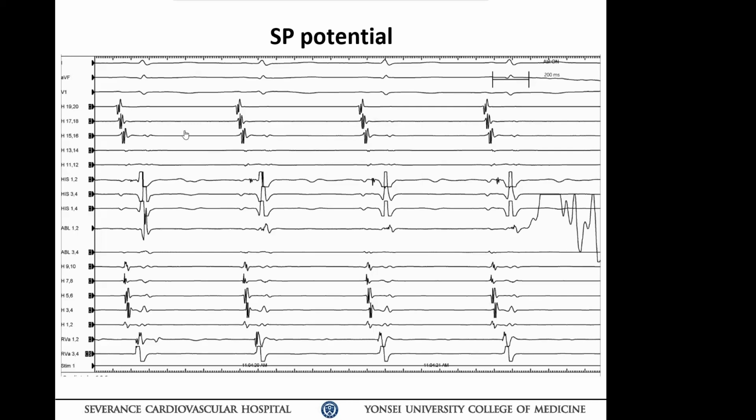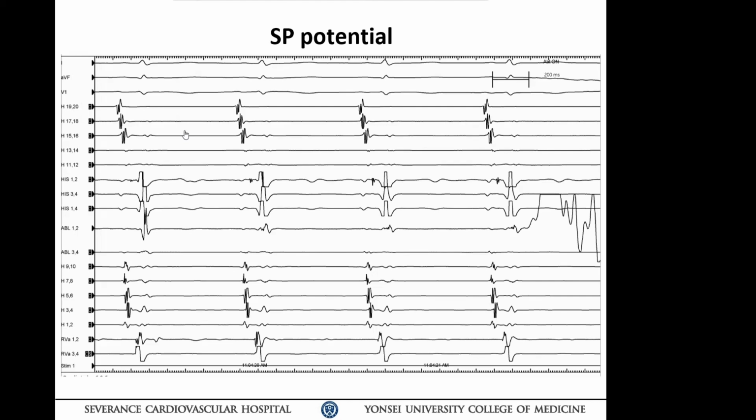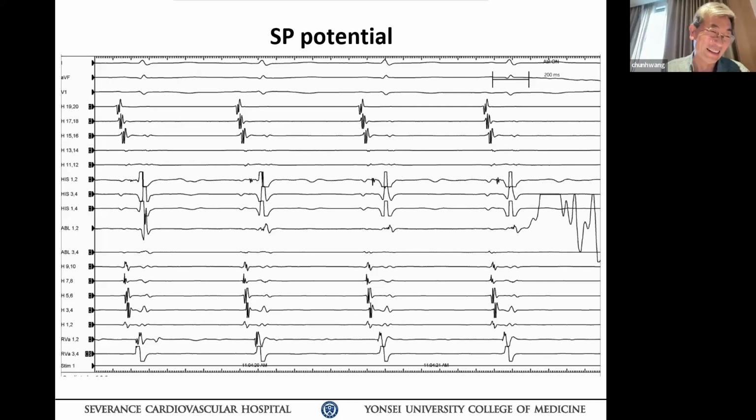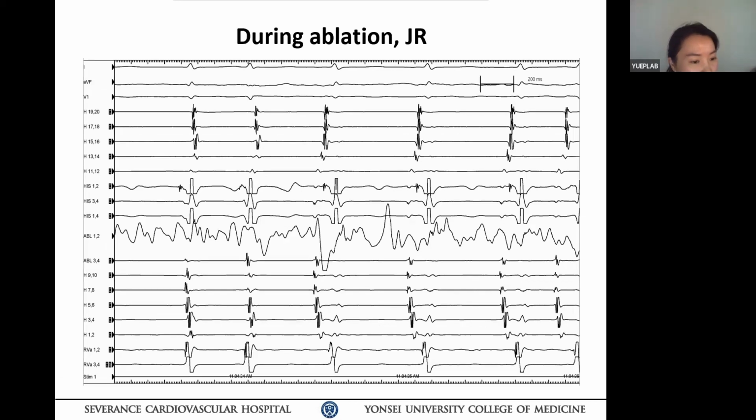I have critical comments, Dr. Che. In which EP lab did you do this procedure? You don't know? Room 7? Next slide, please. I don't allow this kind of noisy signal during RF ablation. Next slide, please. What a shame. It isn't an academic center's electrophysiology lab. Did you tell the technicians to fix it, Dr. Che? No. I didn't tell the technicians about this problem.